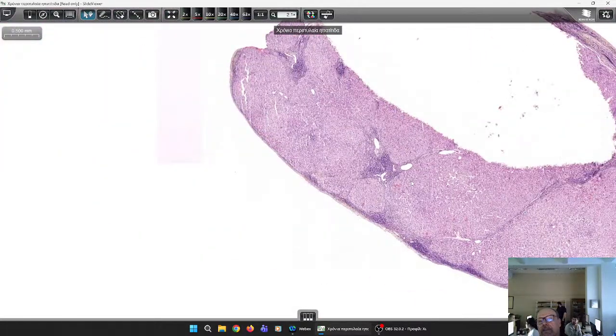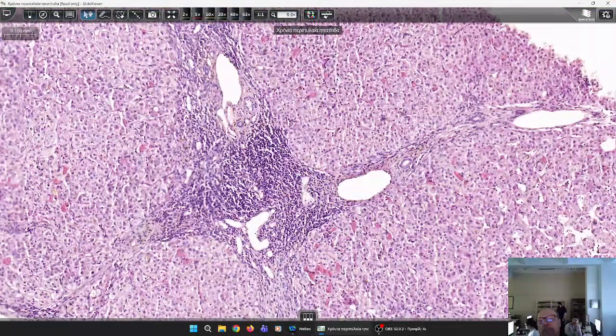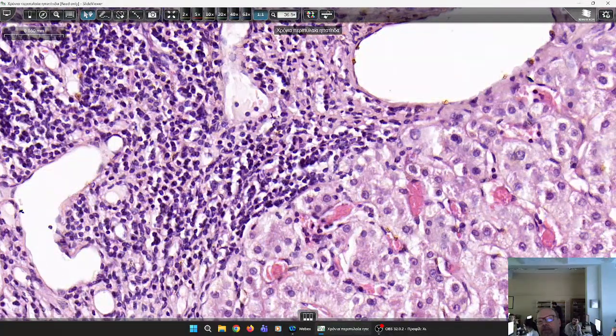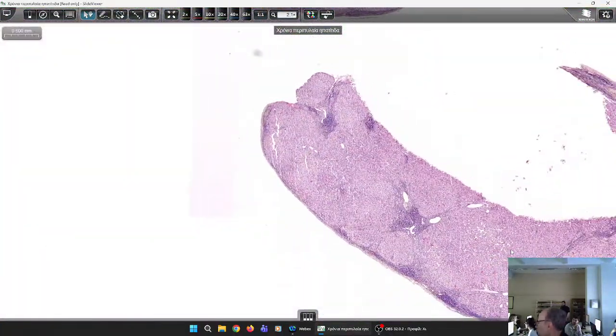However, it is in the form of a biopsy, and what I was saying is some sort of periportal activity here of the inflammation. Exactly. So you can see that the offending agent is still there, and the procedure is ongoing, and this may end up as full-blown cirrhosis. You already have bridging fibrosis. Bridging fibrosis, yes. I explained that to the students. You have the regenerative nodules.